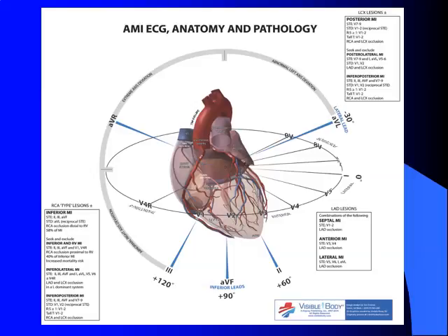So here is a graphic representation of what we're looking at with our 12 lead EKG. Starting at the top left, we see AVR. What that's looking at is kind of a transverse picture, since the electrical conduction is flowing down from the right atrium down to the apex of the left ventricle. AVR is looking backwards, which is why it should always be a negative deflection. And that gives you the hint of why that's more or less of a throwaway lead for looking for ST elevation. Going down and around, you see leads 3, AVF, and 2.